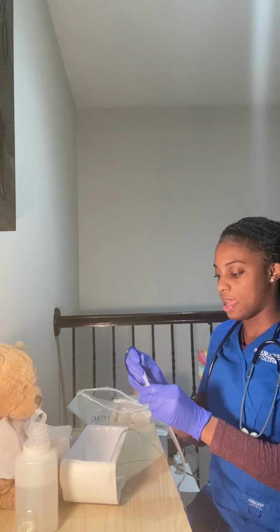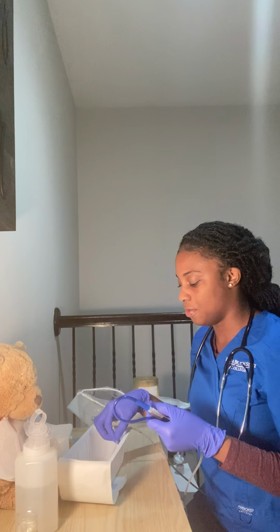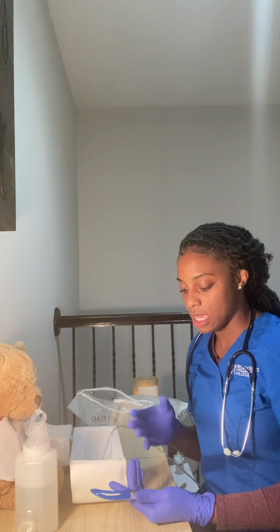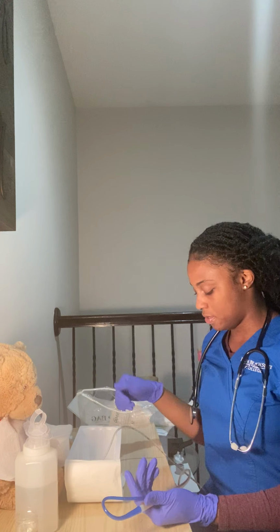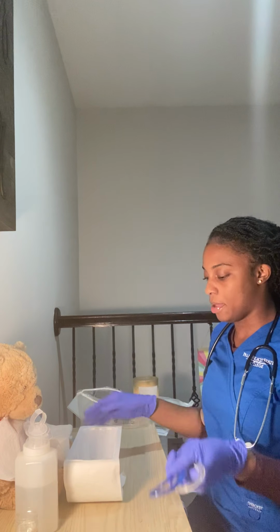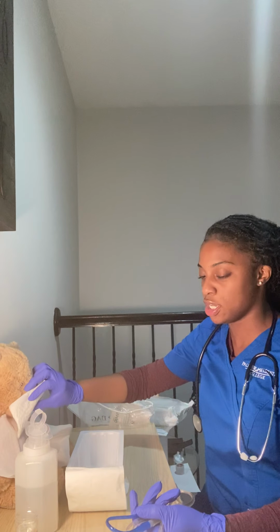So now that I know that, I'm gonna go ahead and clamp it back off, because when I insert it, I don't want whatever I get back from the patient's abdomen to come back out, okay? So now that all that's ready, I've got some paper here just in case they need to blow their nose. So he's gonna go ahead and blow his nose.